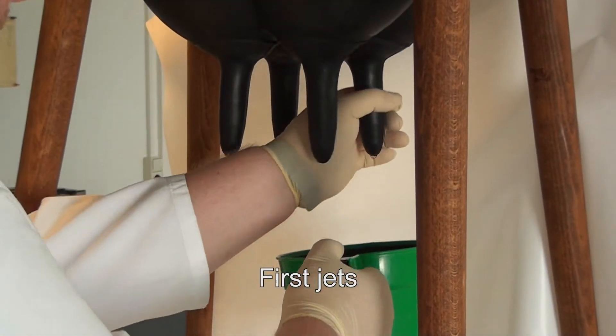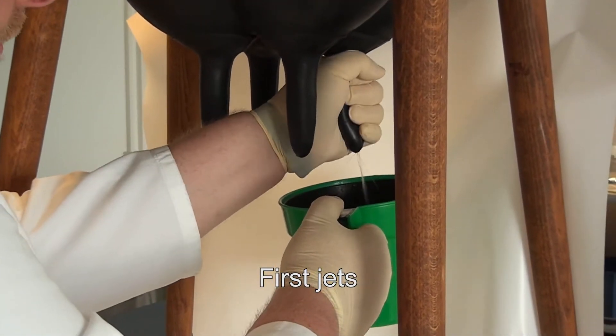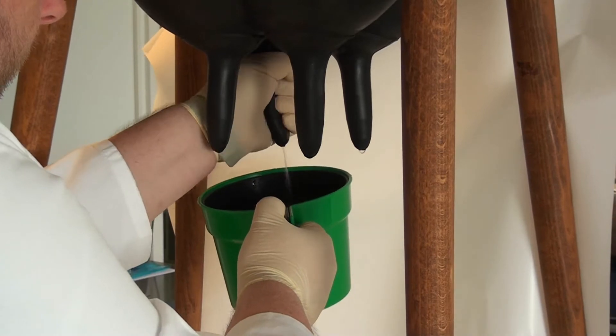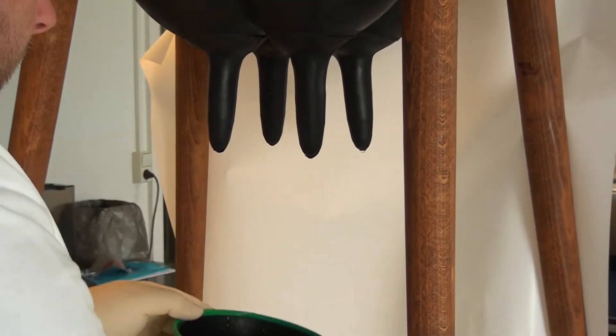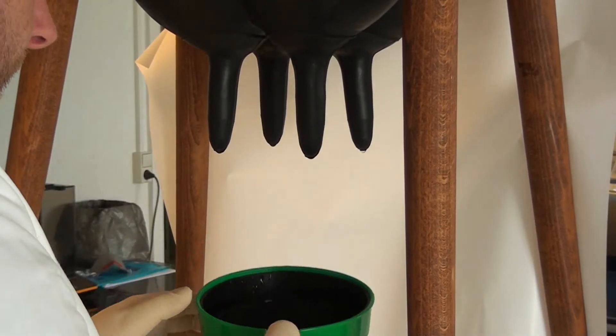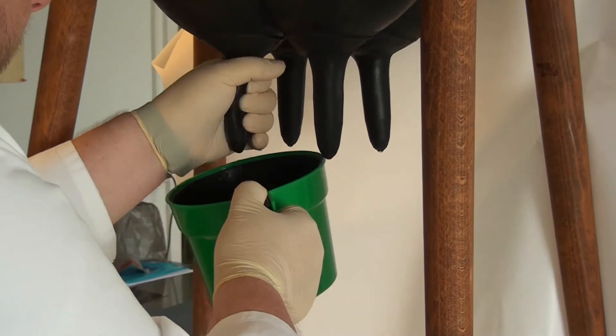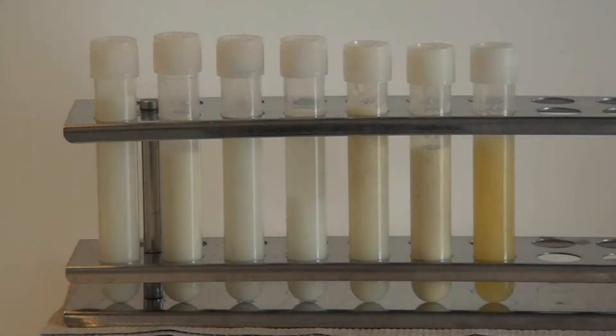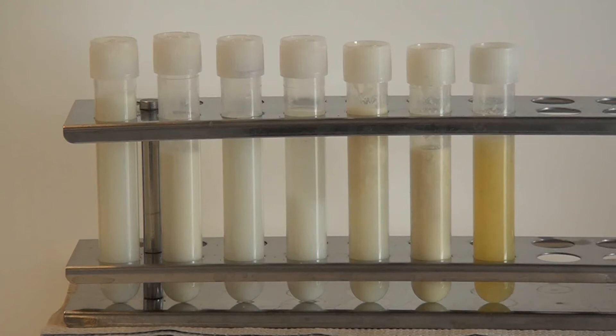The first jets are milked into the strip cup and evaluated visually. Changes in the consistency of the secretion are indicative of clinical mastitis. For the milker, this step decides whether the cow is milked into the tank or if her milk is dumped afterwards. Tubes from left to right contain secretions in decreasing quality, from clinically inconspicuous to strongly impaired. When these secretions are moved, clots become more visible in some tubes.